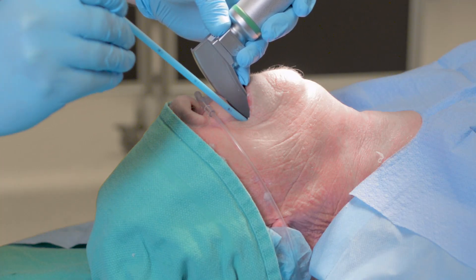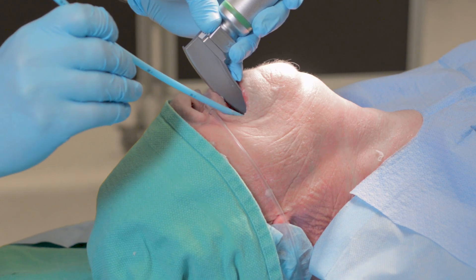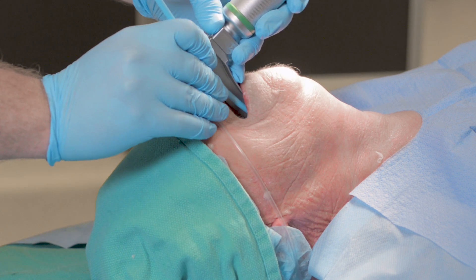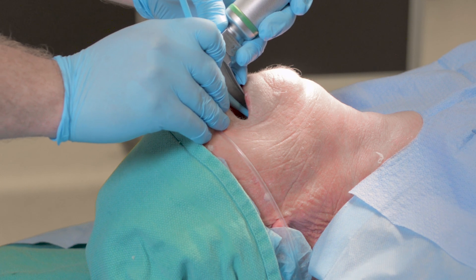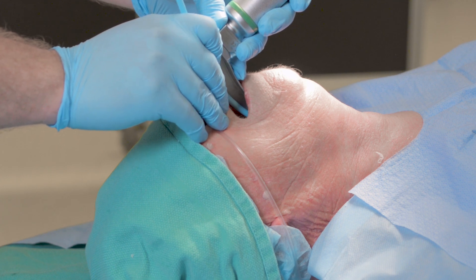We're going to advance the bougie down through the vocal cords, occasionally feeling tracheal clicks as we go. If you don't feel tracheal clicks, that's fine — don't make critical decisions based on tracheal clicks. If that bougie is in the right position through the vocal cords, it will come to a hard endpoint, giving you confirmation that it's in the right place.